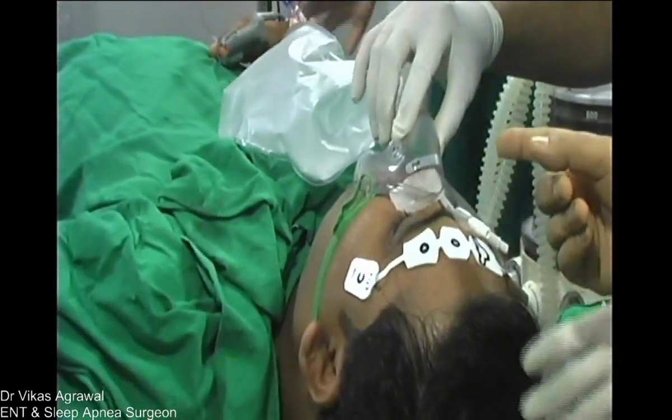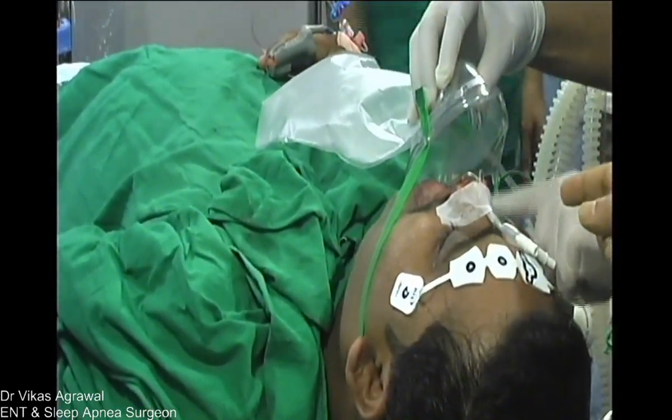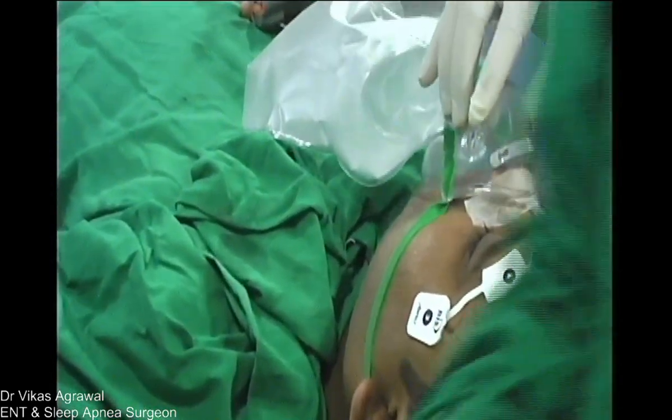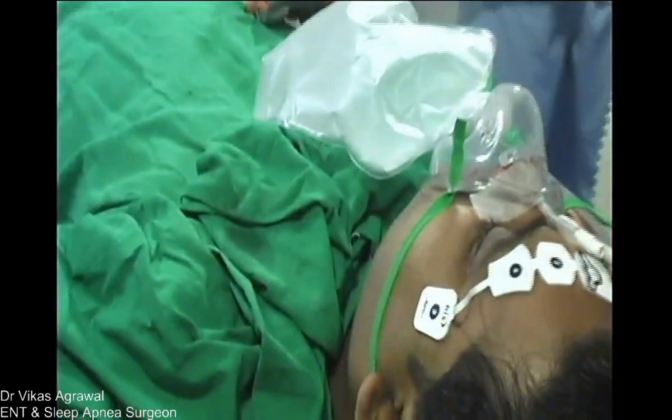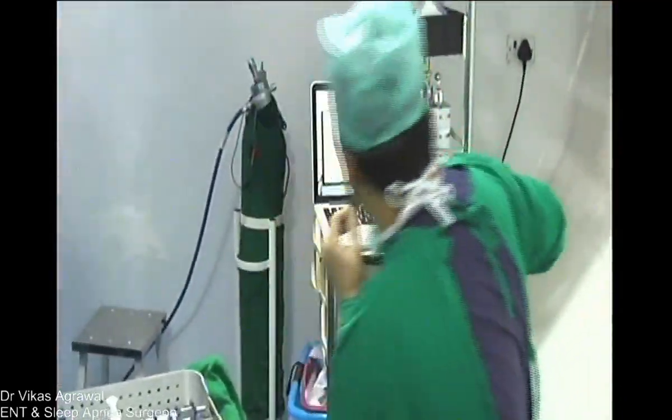So even if the nose is blocked, there is a little airway. Show me your tongue. Okay. So that's it. He'll be shifted in a few moments. Till that time, I'll show you a few other drug-induced sleep endoscopy videos.